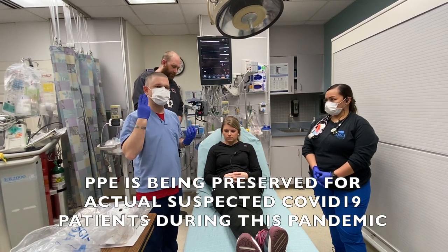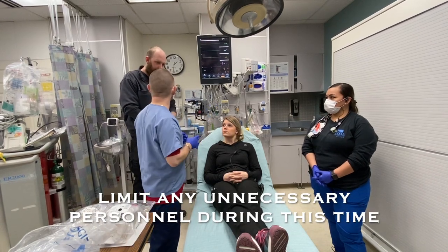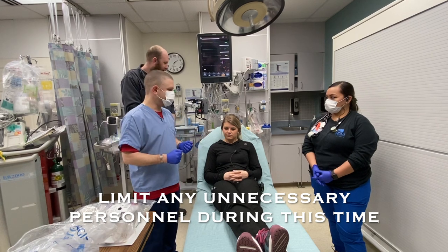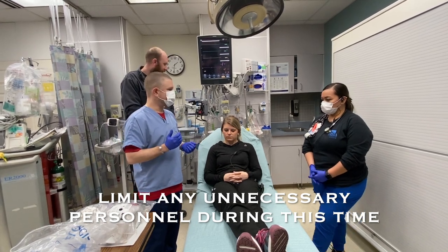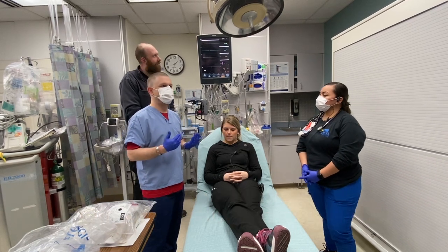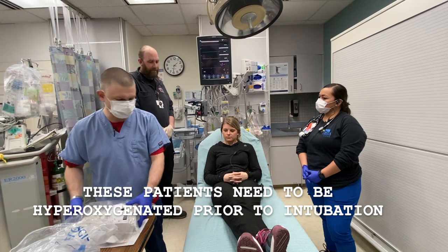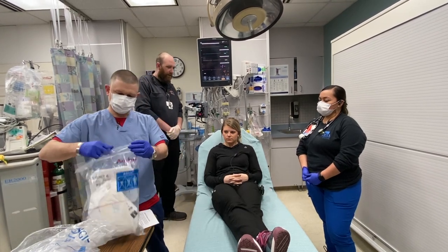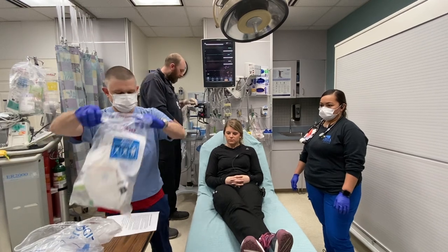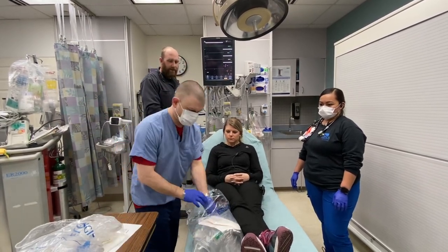We are going to do this in a team of three: one nurse, one registered respiratory therapist, and one provider. We are going to come in with a plan to intubate the patient. But before we do that, we want to achieve the highest oxygen saturations we possibly can. So we're going to grab our pre-ox pack that will be available in our clean utility room.